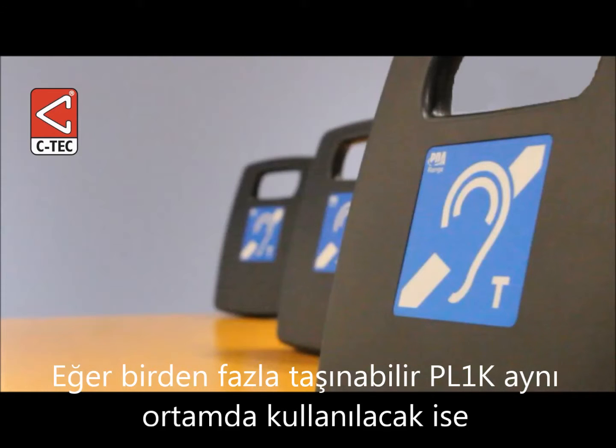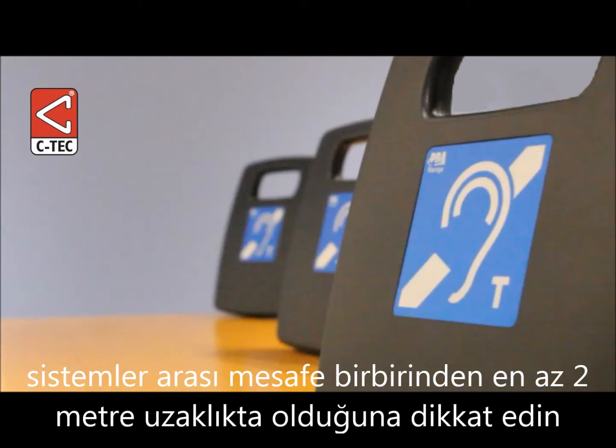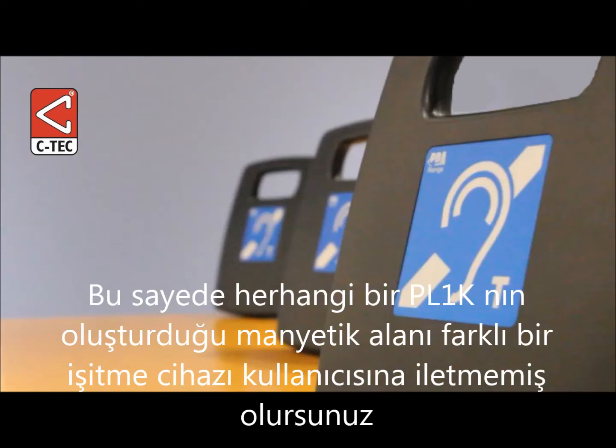If multiple portable induction loop amplifiers are to be used, take care to ensure there is a gap of at least 2 metres between each system to avoid the field being generated by one system being picked up by another hearing aid user stood or sat at another system.